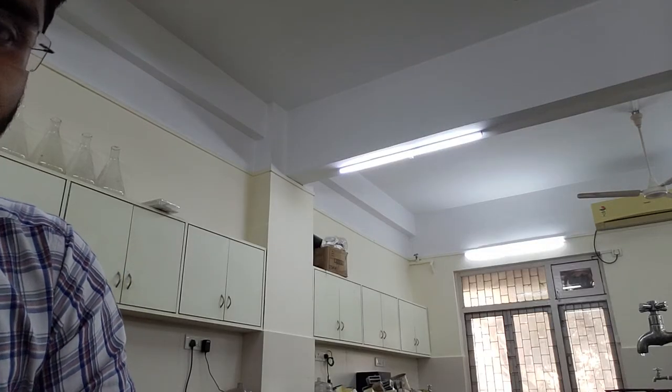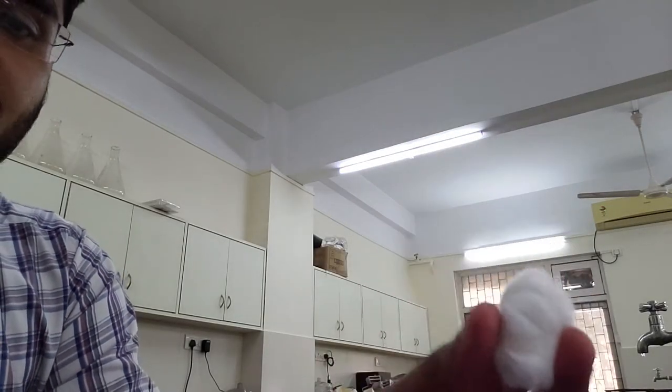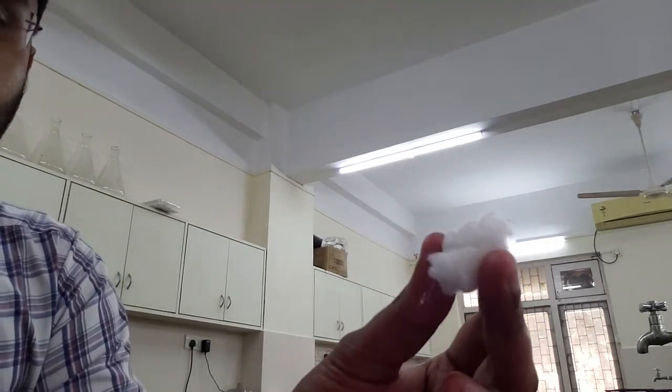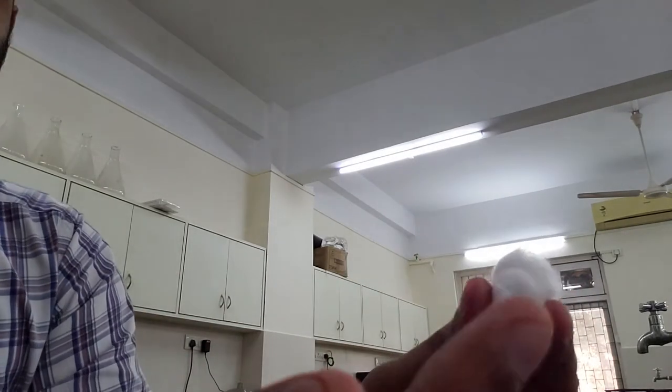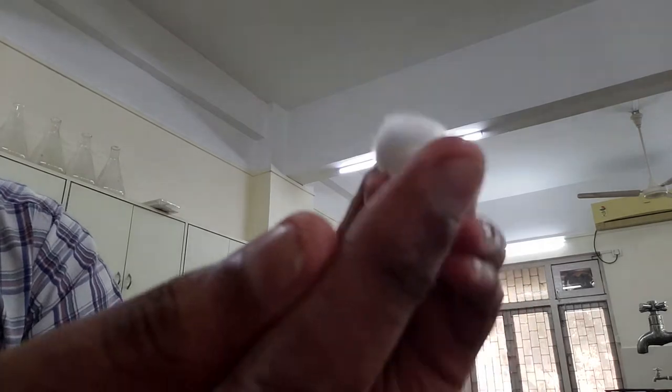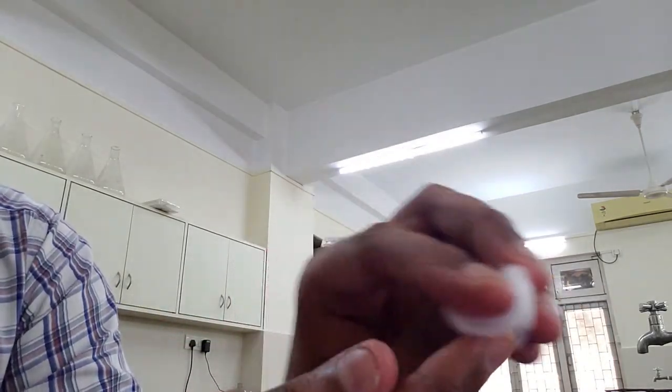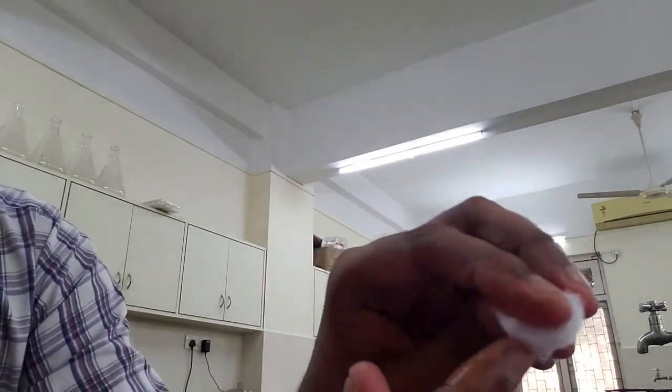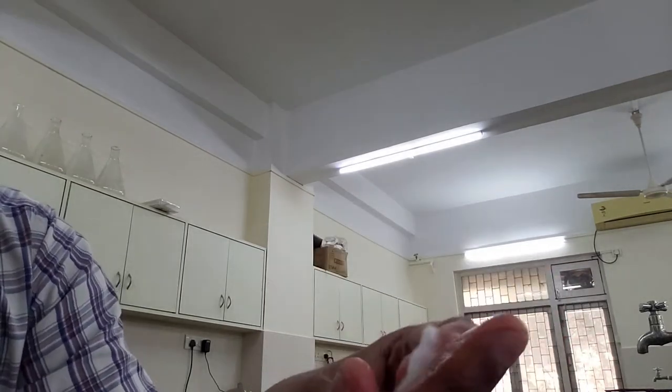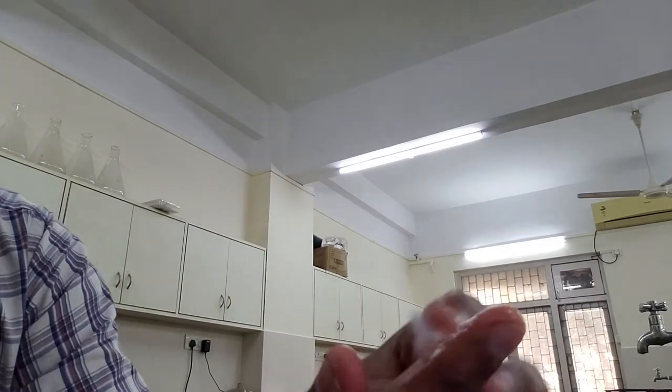First of all, I have taken a clean cotton which has alcohol in it. The finger on which I'm going to prick myself, I will clean that with alcohol properly. This is a kind of surface sterilization and cleaning.